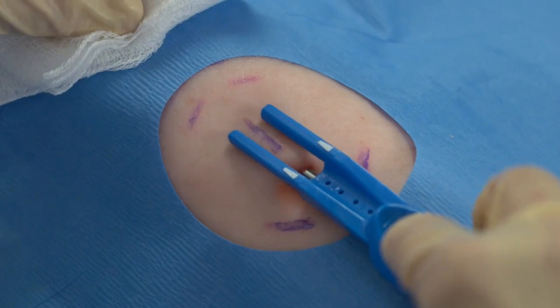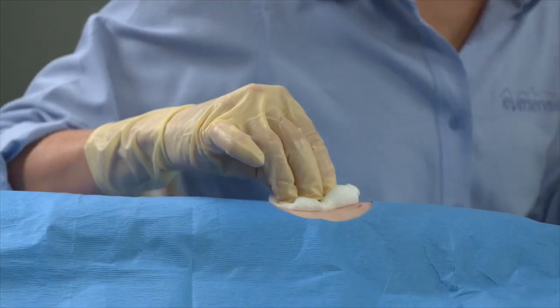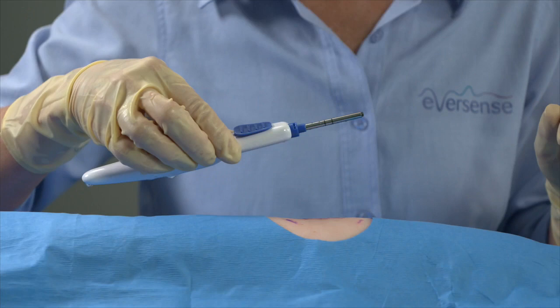Remove the blunt dissector and return it to the insertion tool tray. Use sterile gauze and apply pressure to control bleeding if necessary after creating the pocket. Next, with your dominant hand, pick up the insertion tool loaded with the hydrated sensor. Keep your fingers on the sides of the tool and avoid touching the blue slide.